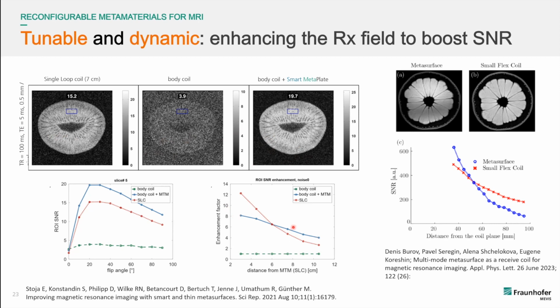And there is other work which also shows similar effects. In that case, they are showing that the metamaterial can be better, even closer to the coil as compared to an individual coil. But we are not exactly sure where this comes from.